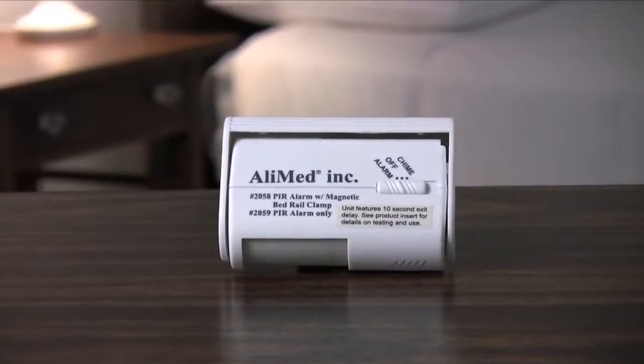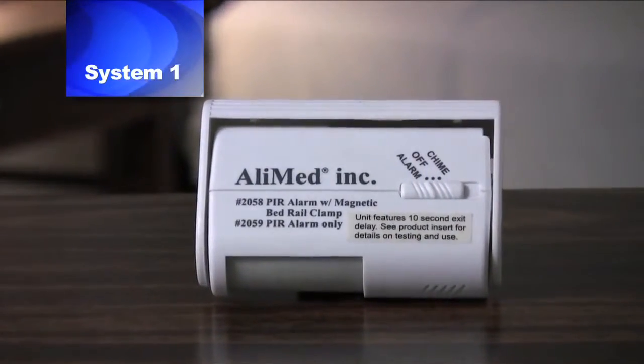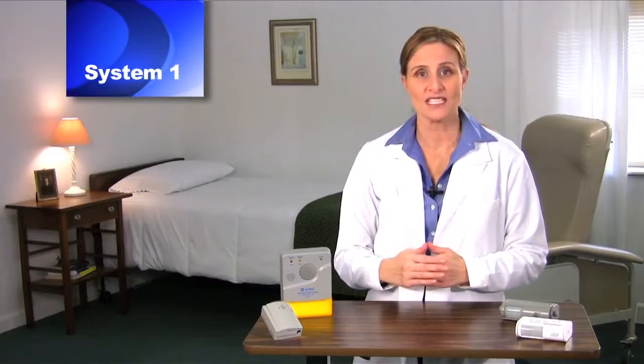The PIR alarm system is available in four different configurations. System 1 includes a self-contained alarm sensor unit that sounds at bedside only. When activated, the alarm sounds for 30 seconds before automatically resetting itself. As long as there is motion in the sensing field, however, the alarm will continue to sound. The sensor unit features an on-off switch and two alarm tone options: alarm or chime. For mounting, choose either the bed or wall mount. For more detailed instruction on System 1, please see video 1.